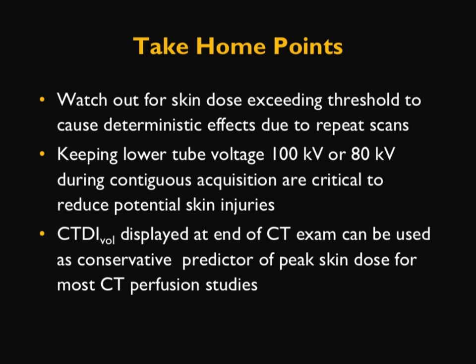First and foremost, in good CT perfusion studies, one must watch out for skin dose that can exceed the threshold to cause deterministic effects due to repeat scans. By watching the skin dose and the technique set for CT perfusion, it becomes imperative for the clinic to make sure that the protocols are optimized in order to do safe CT perfusion studies.